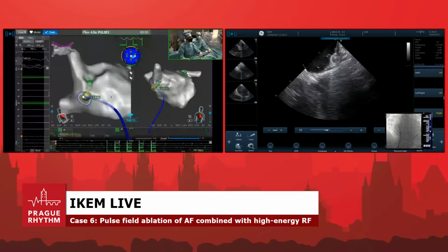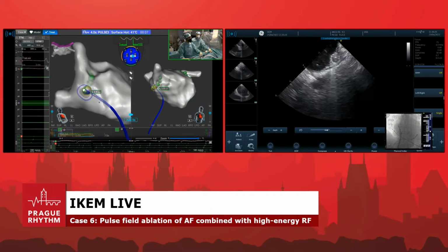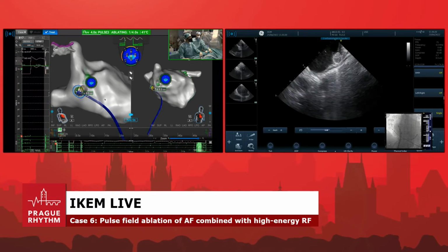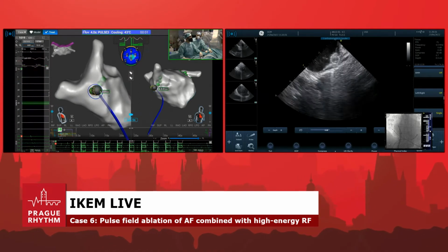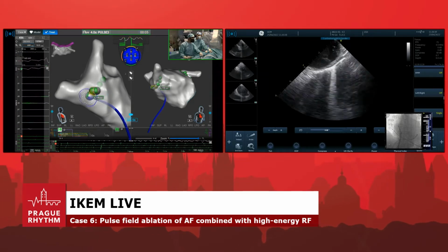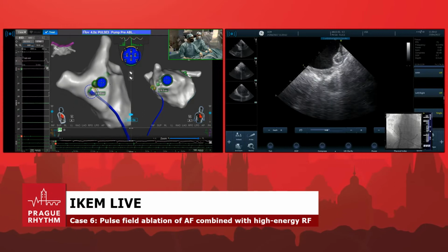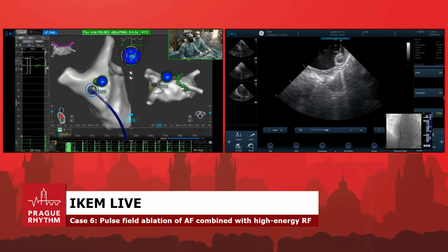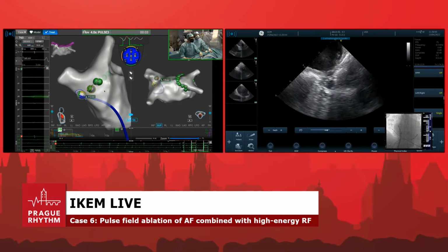Maybe you can also appreciate the ICE, the contact on ICE. Yeah, that's what we were discussing, that this catheter very nicely sits on the tissue because it's a little bit rough, it does not slide like a conventional tip, and it is still flexible, so you can really adjust the contact with the tissue. So it is very nice to manipulate the catheter.